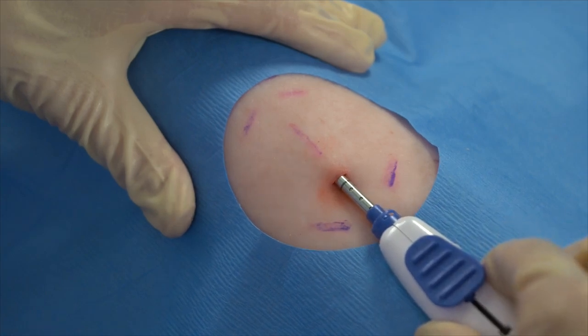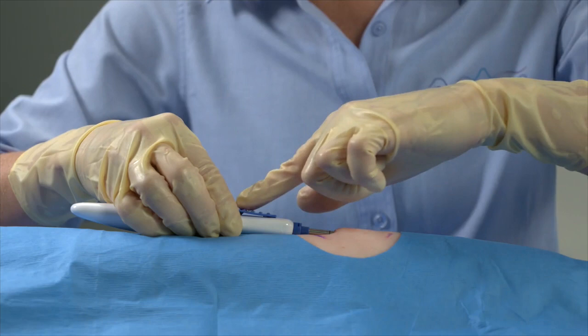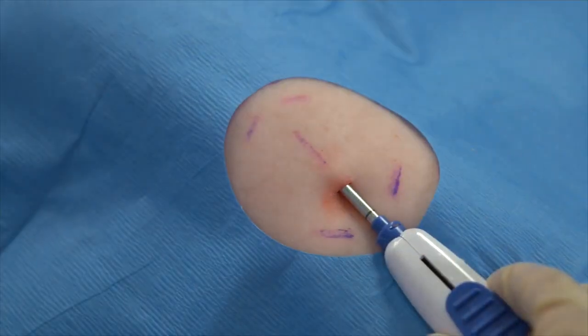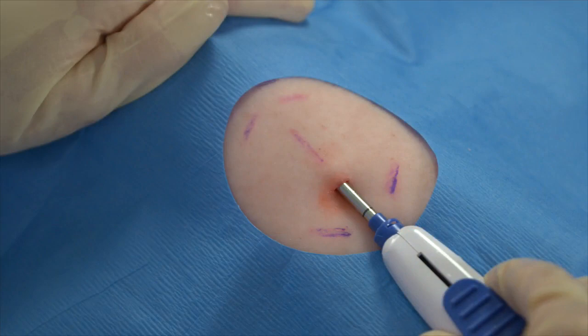Just before you deploy the sensor, stabilize the tool with your dominant hand. Being careful not to dislodge the tool from the incision line, use your other hand to depress the back of the blue slide to unlock it. Then, push the blue slide away from the incision to retract the cannula, leaving the sensor in the pocket. The blue slide locks into place when it is fully retracted. Keep it in this retracted position.